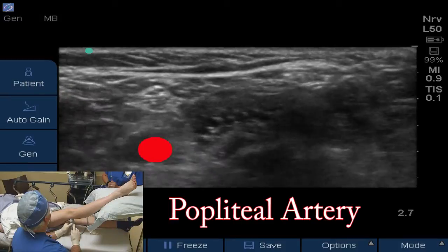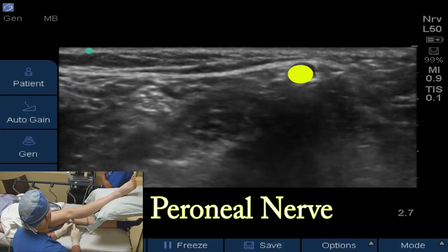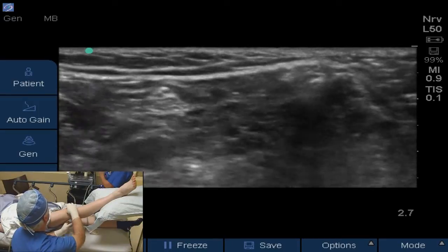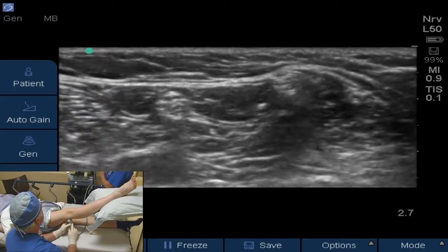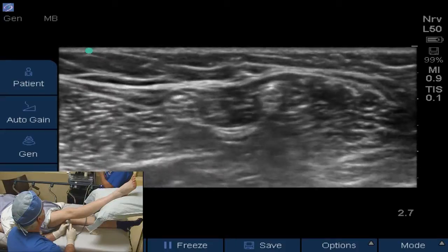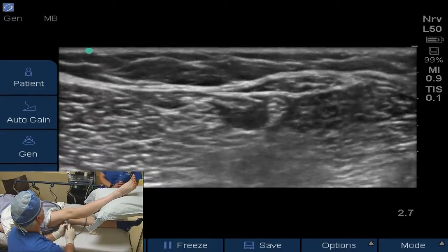Just above the popliteal artery at 12 o'clock you see a nice tibial nerve, and then just to the right of the tibial nerve is the peroneal nerve. It's a little more superficial towards the skin. The two nerves in the popliteal fossa are separated, and as we slide the probe up approximately along her leg, you'll see the tibial and peroneal nerves very well. The popliteal artery is still beating. As the nerves approach each other and get closer together, the artery is going to dive deeper into the leg and go away from the nerves. So the vasculature is not a problem on this block.